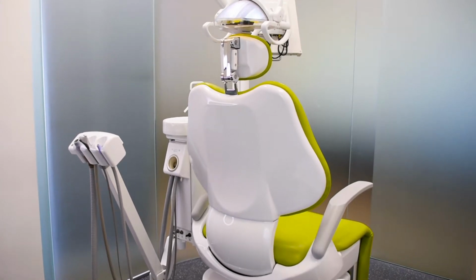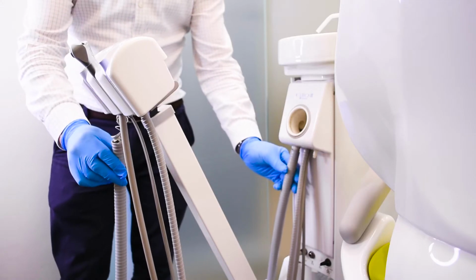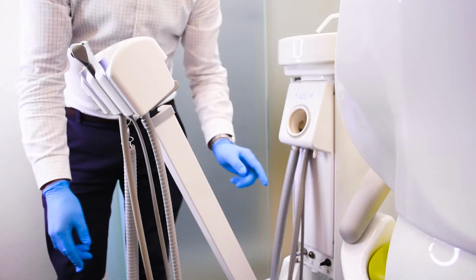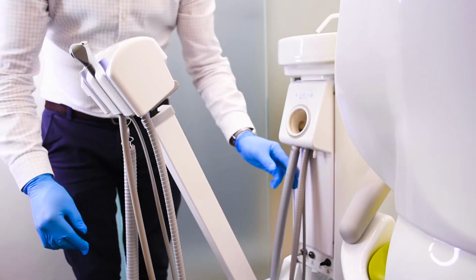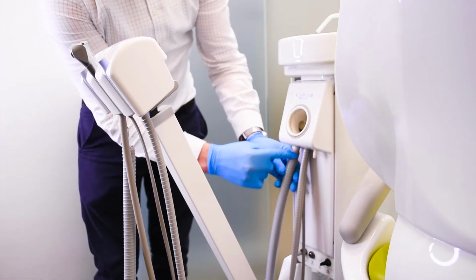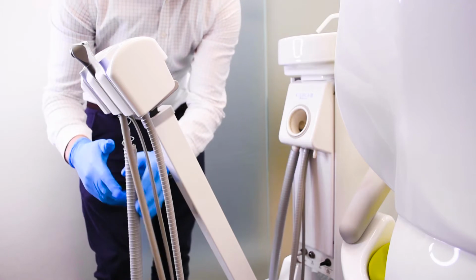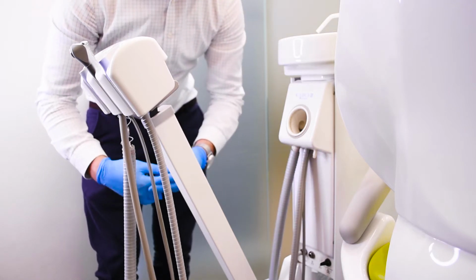So in this video we'll be looking at changing this high volume suction hose. The same applies to the saliva ejector hose, and this is specific to the Belmont chairs. So the suction hose is disconnected from this point here and from the bottom of the tip valve, this point here. So the first step is to remove the old hose.